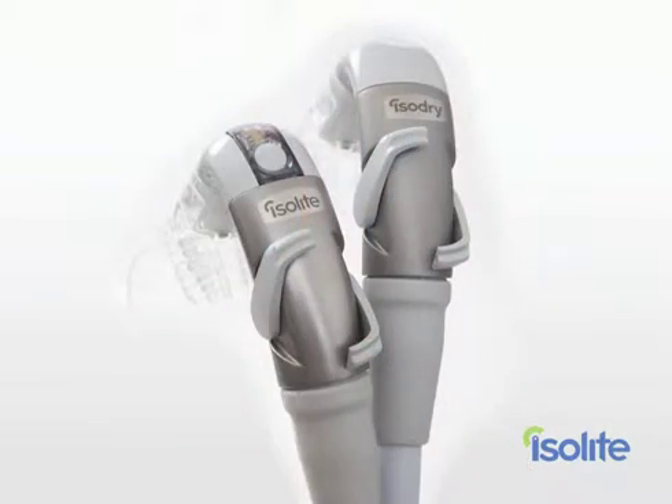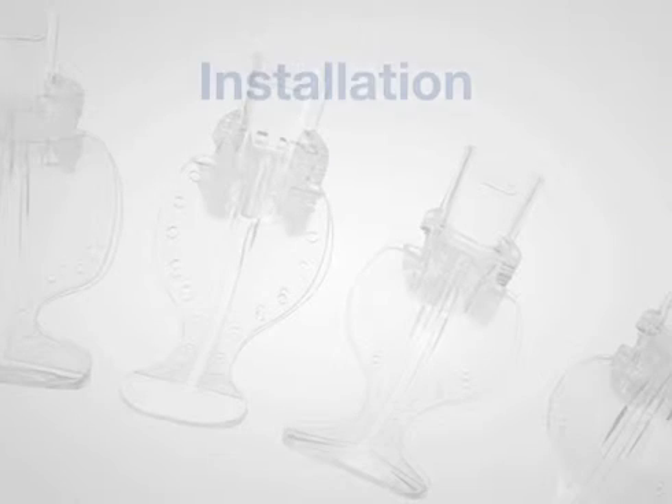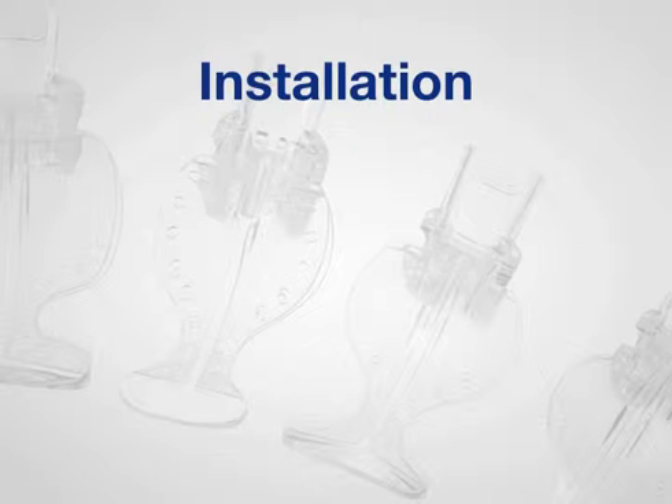Let's jump in and get started. My dental assistant Denise will take you through the installation process. For most dental practices with standard modern equipment, installing the Isolite Dryfield Illuminator or Isodry is going to be a snap. I found I could do it myself, and I didn't have to call in our equipment technician. You're going to want to allow about a half an hour for each system that you install, but most people tell me it really only takes about 15 or 20 minutes.